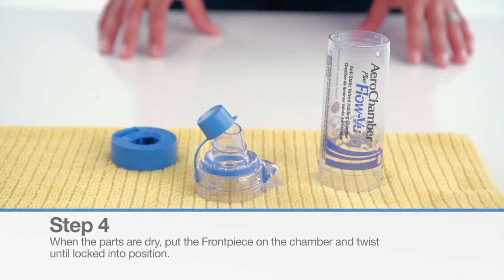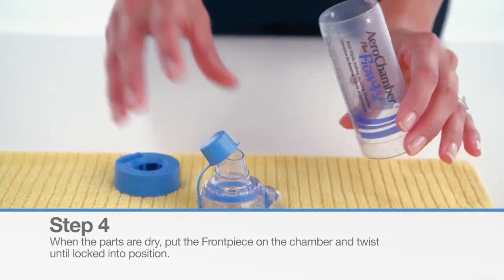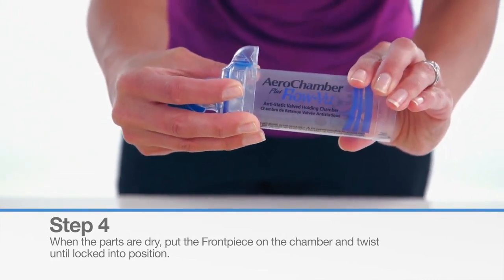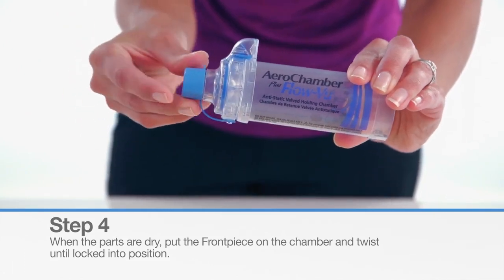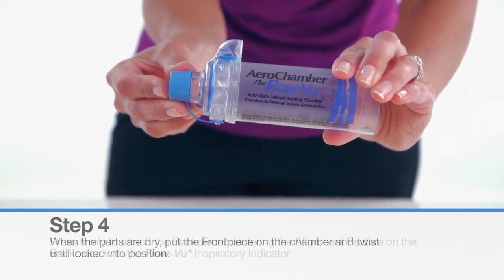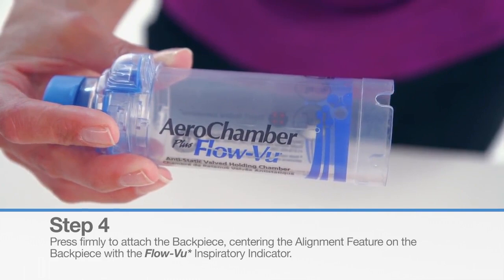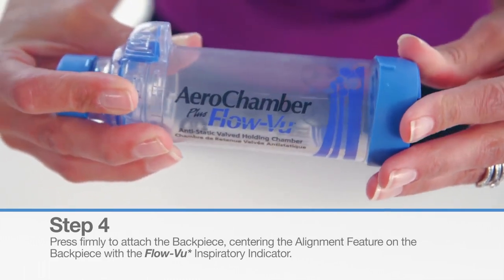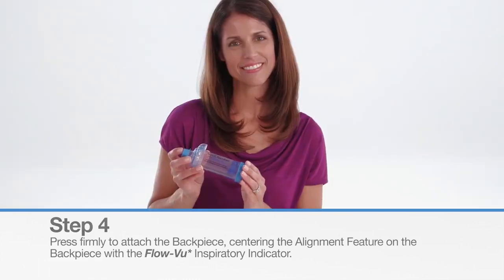When the parts are dry, align the front piece of the chamber and twist until locked into position. For mouthpiece models, the protective cap should always be placed on the mouthpiece when the chamber is not in use. Press firmly to attach the back piece, centering the alignment feature on the back piece with the FlowView Inspiratory Indicator.